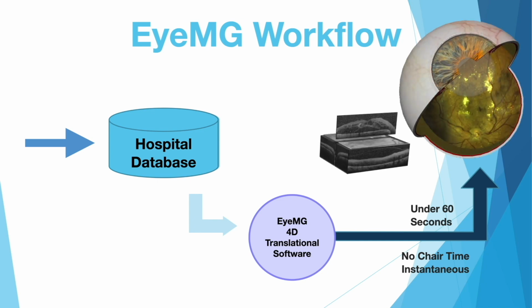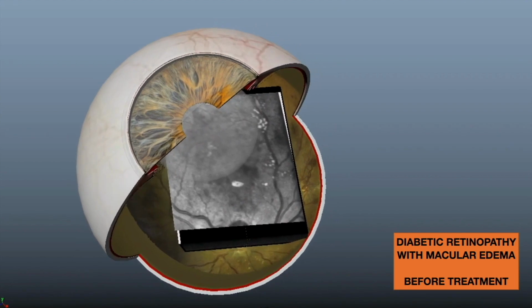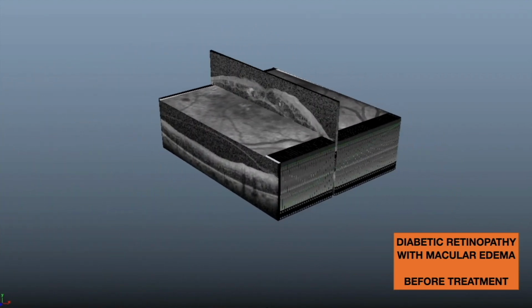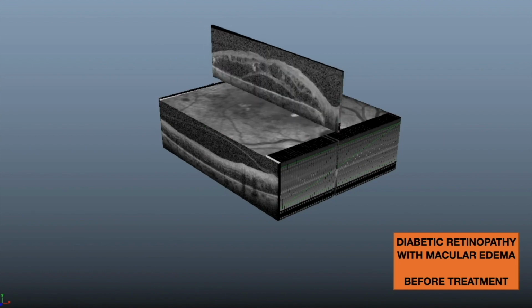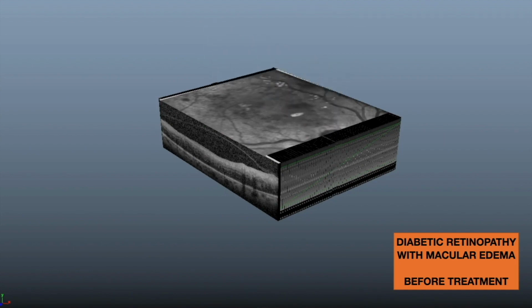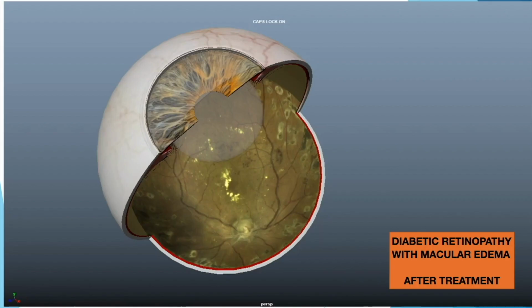Now, in the fundus holograms, you will have the OCT slices embedded into it. The doctor can choose different slices of the OCT images to make the diagnosis of diabetic macular edema as seen in this patient. Before treatment, the patients can be counseled with their own holograms for making them understand the disease process better.